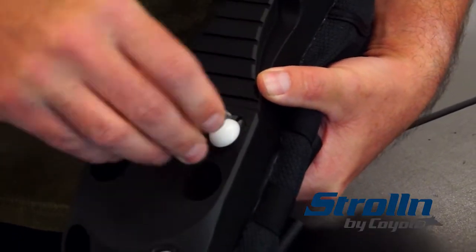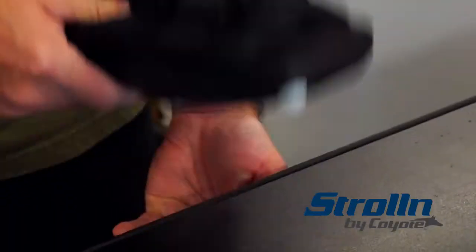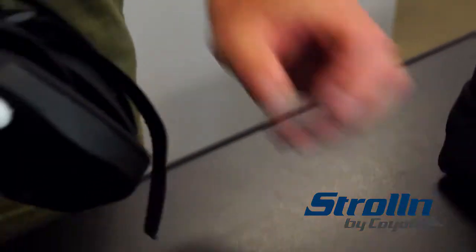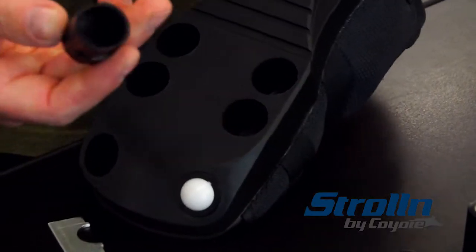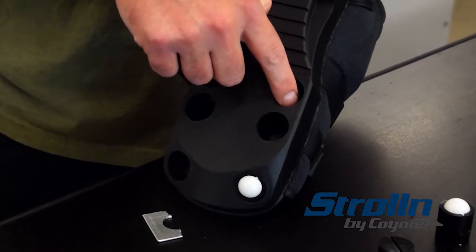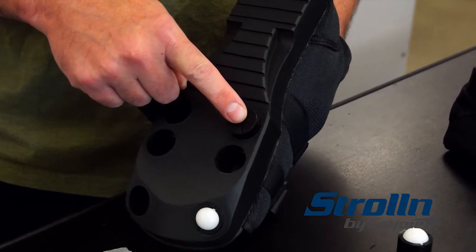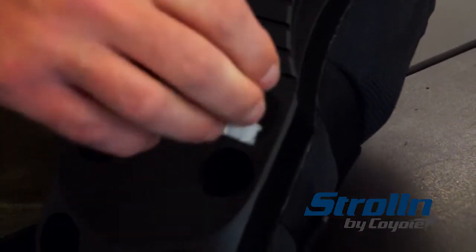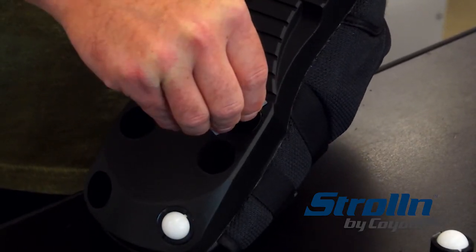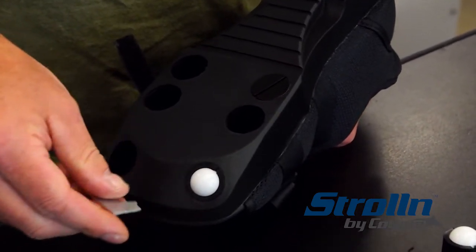They'll be locked like that. All you have to do is put your key in, turn it, and the bushing comes out. Take your plug. The plugs have some grooves in them and they lock into the bottom of the sole, and you just have to line those up correctly. And you find them, it'll drop right in. Take your tool and turn it clockwise, and then it's locked in. And you'll do that for the toe as well.